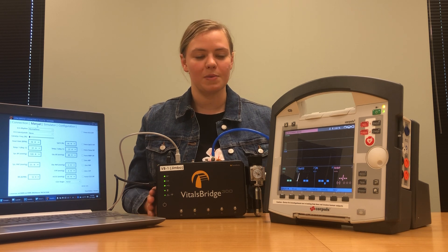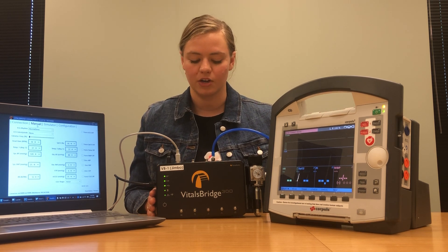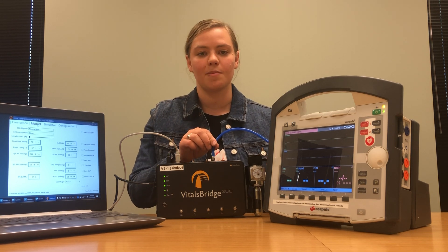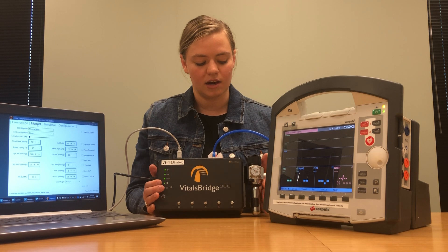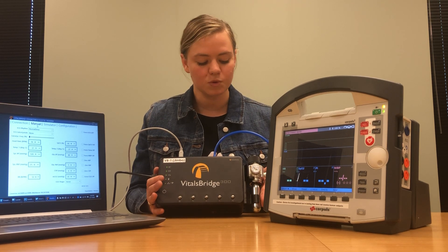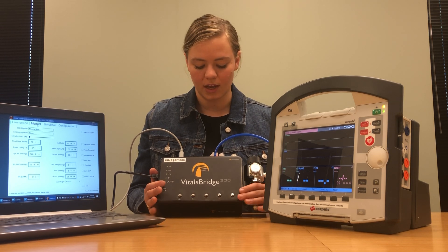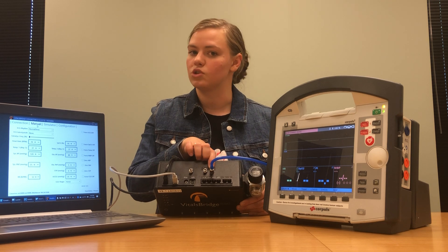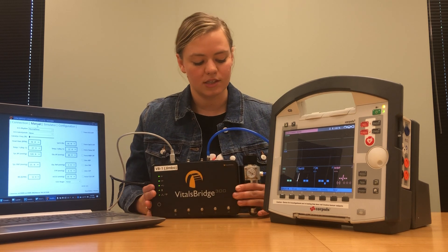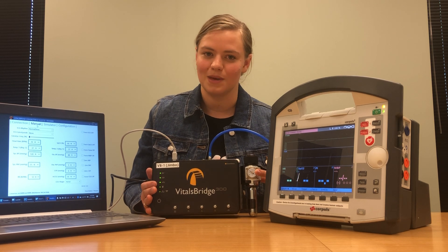Since we will be connecting to a capnography system on our Core Pulse patient monitor, I've connected a carbon dioxide supply to my unit. I'm using the carbon dioxide supply that comes with the VitalsBridge — a small carbon dioxide canister and pressure regulator — connected to the little tube that says CO2 in. I've also adjusted the pressure of my regulator to be between 15 and 20 PSI.